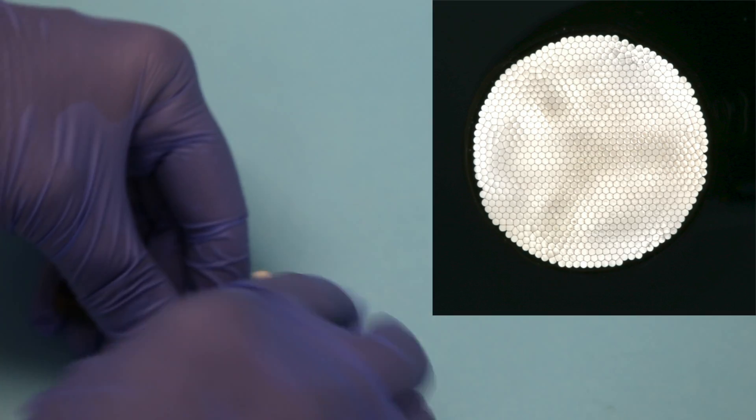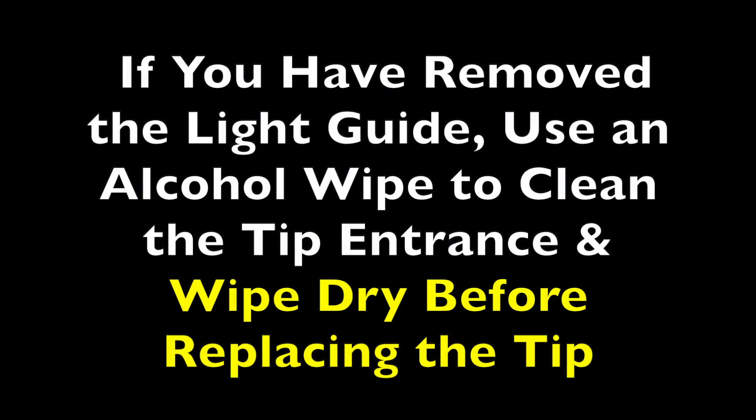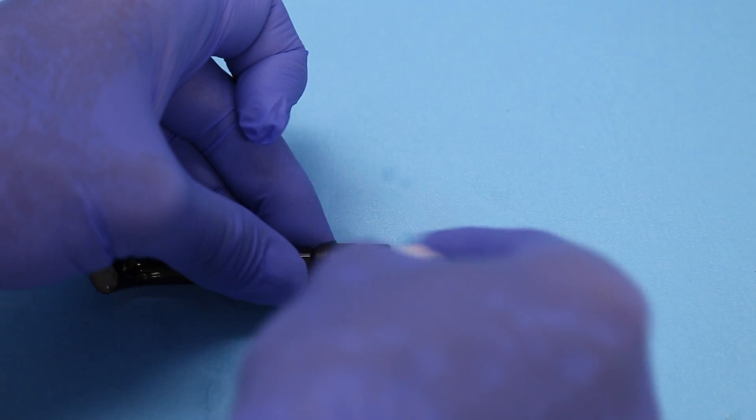Here we can see it's nice and clean. All the composite was removed. You should use an alcohol wipe to clean the entrance of the light guide, that's where the light goes in, and remove any debris that's there.